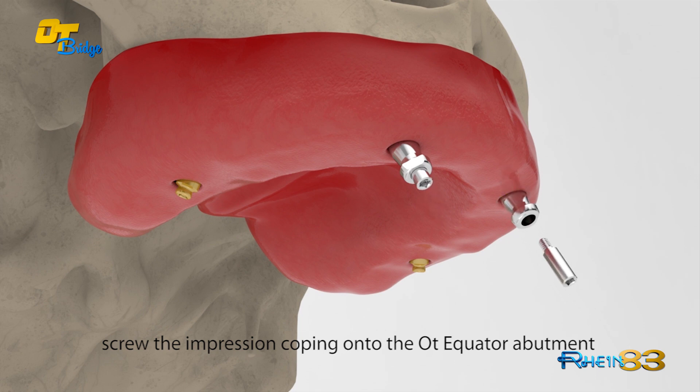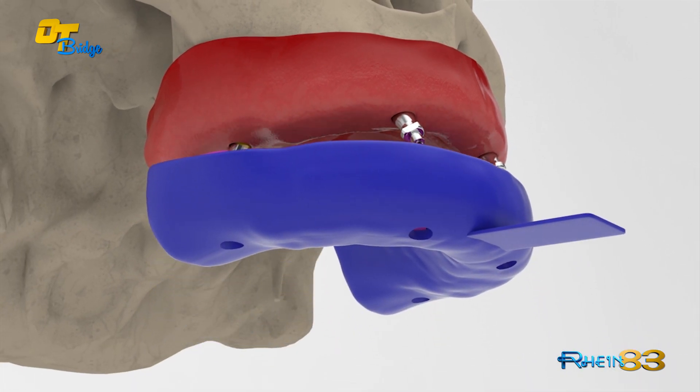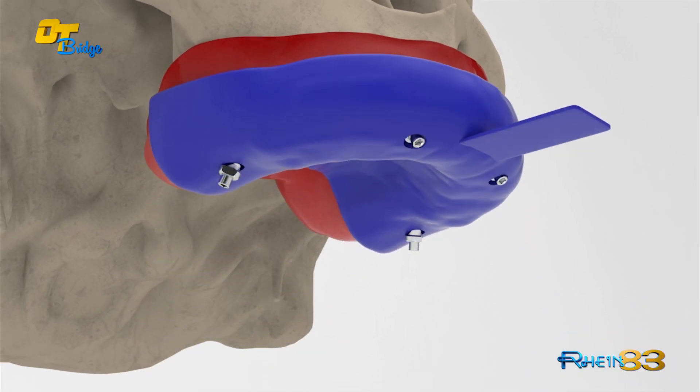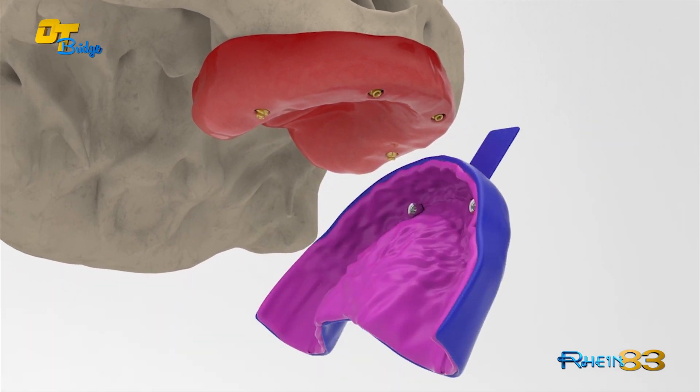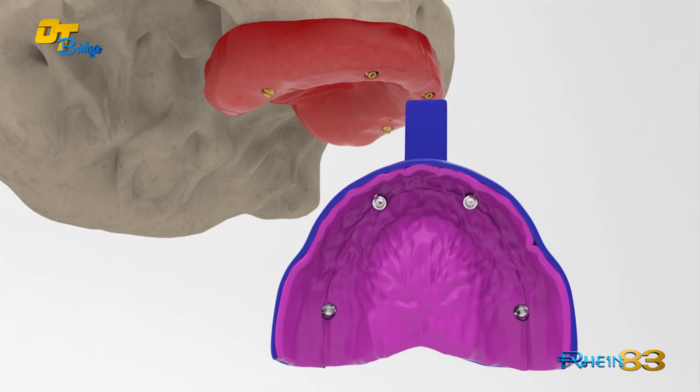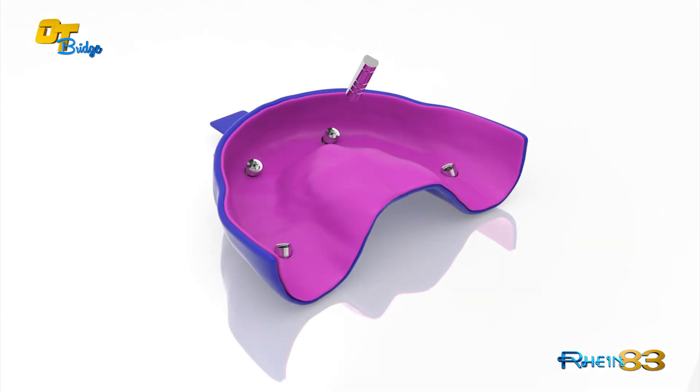Impressions can be done with the traditional techniques, with the impression copings and the analogues. Also, the production of the master model can be completed with the traditional techniques and materials.